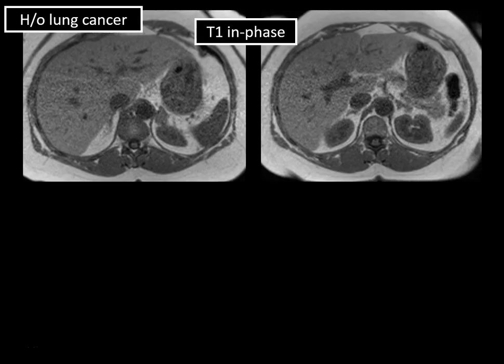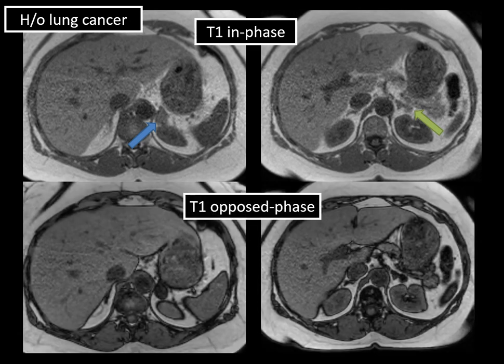This patient also had a history of lung cancer. Looking at T1 in-phase MRI images through the adrenal glands, there's a left adrenal nodule superiorly and another more inferolaterally on the left. On the T1 opposed-phase MRI images — identifiable by the India-ink or etching artifacts surrounding organs at the fat interface — the larger of the two nodules demonstrates signal dropout, becoming dark, as does the smaller one arising from the lateral limb of the adrenal gland. These are both diagnostic of lipid-rich adrenal adenomas.